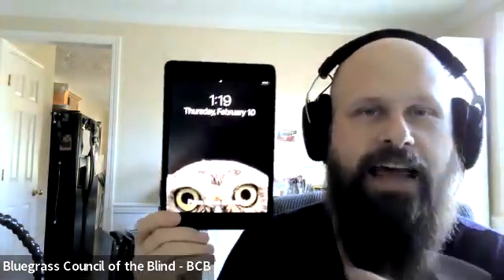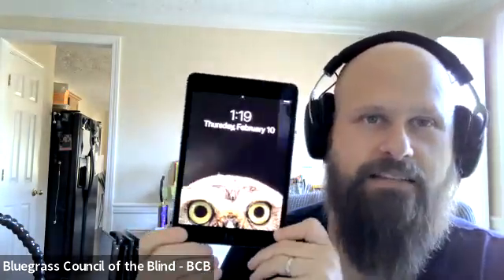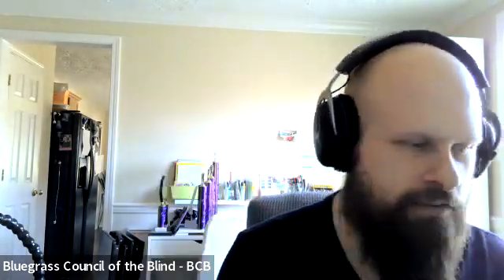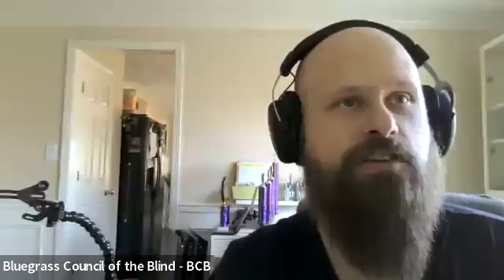So instead, you could maybe grab a tablet of some sort. This is the iPad mini. This is a nice size screen. It's not too big, not too small. I also have the big 12.9-inch iPad Pro, which is a fantastic big screen. I use that for a lot of stuff as well, and that's a nice 12-inch screen. So turning on the camera on there, using that to zoom in on the thermostat, you've got a nice big screen to work with. So that's always an option as well.